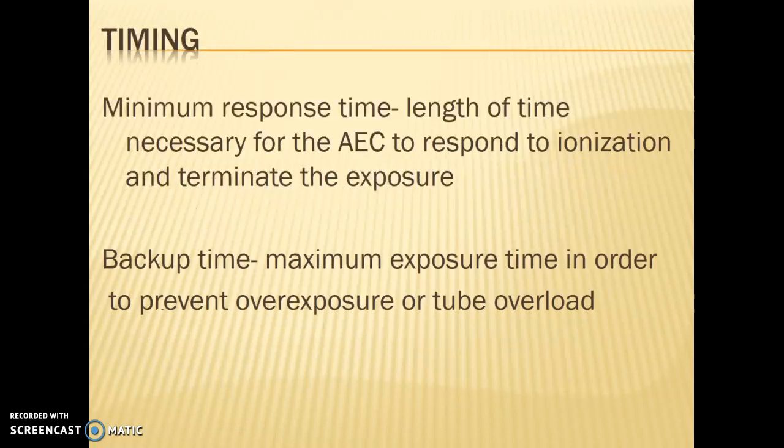The minimum response time is the length of time necessary for the AEC to respond to ionization and terminate the exposure. The backup time is the maximum exposure time in order to prevent overexposure or tube overload.